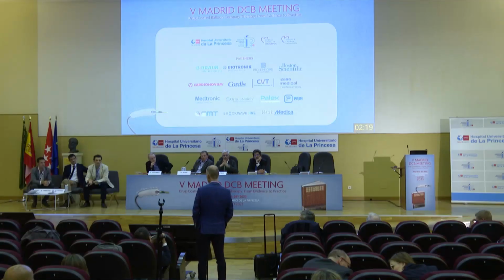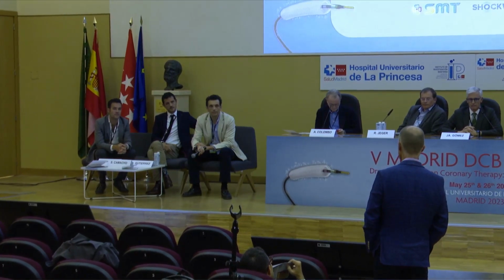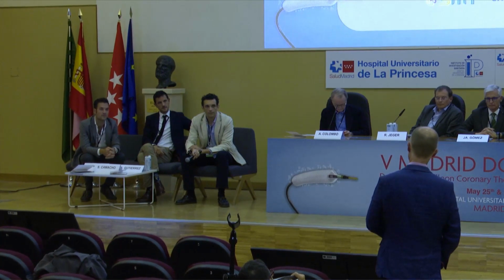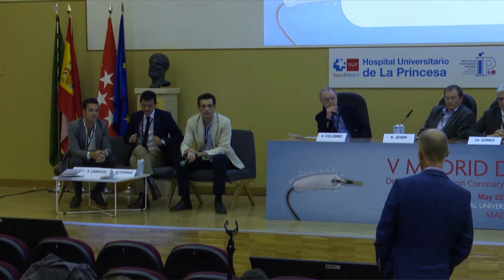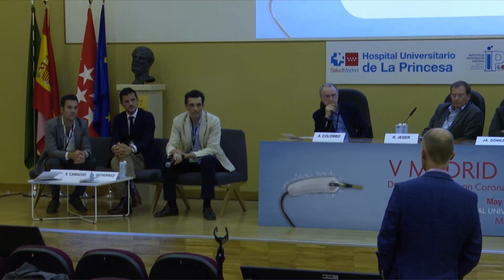No, we've sort of got our own checklist now of how to do a safe drug-coated balloon angioplasty, and it's all about flow, making sure that the contrast isn't hanging up in the wall, because that's usually a bad sign, and the dissections that you can leave, just the intimal flaps. And we do the same now in the left main stem as we do everywhere else. But you've got to bear in mind that we started doing this 10, 15 years ago, so it's taken a long time to get from ISR and small vessel to big vessel to left mains, bifurcations, CTOs, STEMIs, etc. You don't just start it all tomorrow.